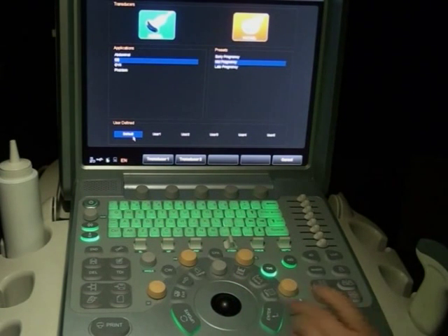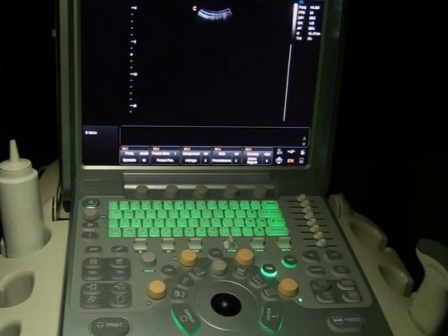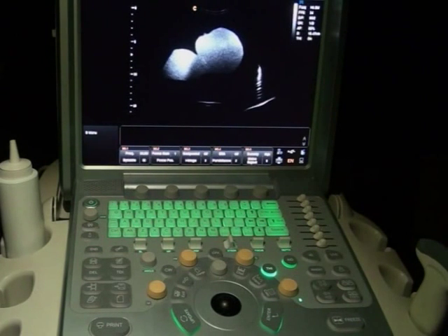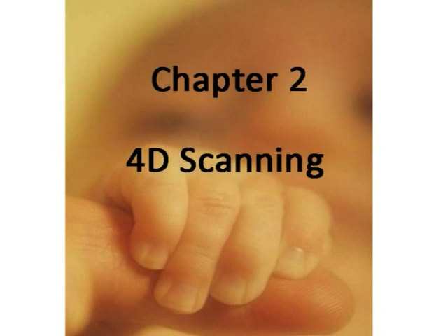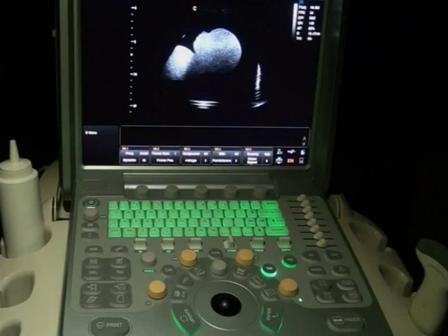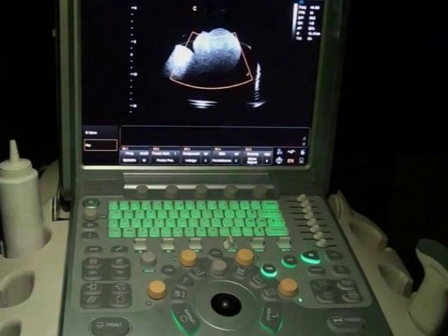Click the Enter key twice and start B mode. Take the 4D probe and find the standard sagittal plane. After getting the sagittal plane, hold the probe and press the 4D key. The region-of-interest box will appear on screen.